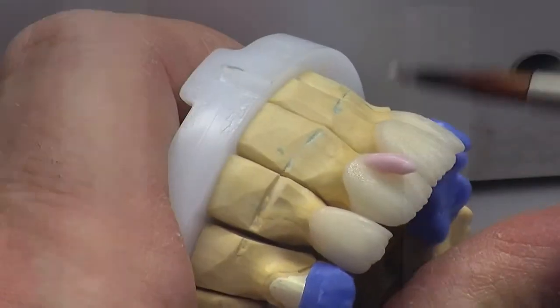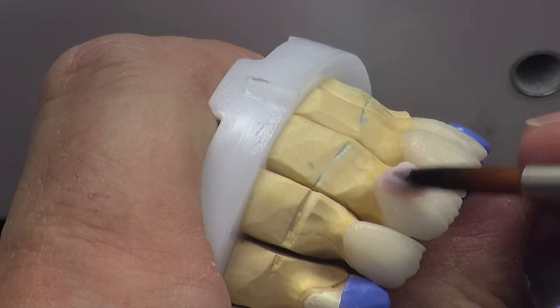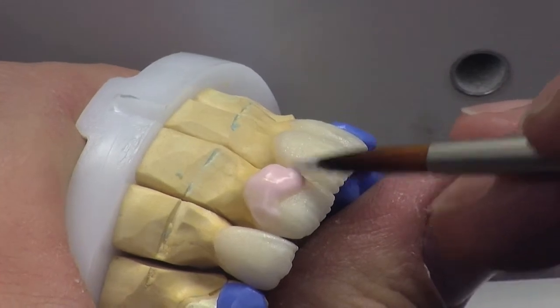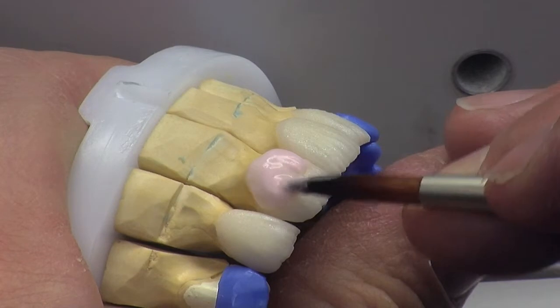What we're doing now is layering our porcelain onto our pre-made substructures. We're not going to be using a lot of complicated colours — it's a very simple shade, 1M1OM3.